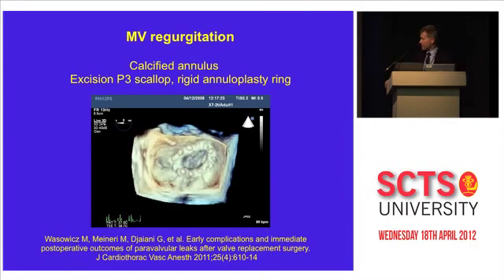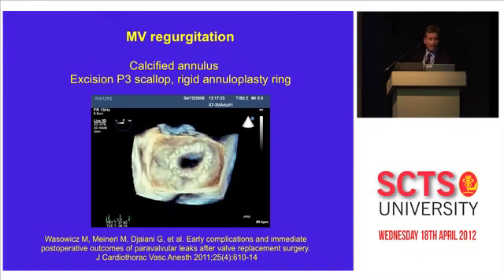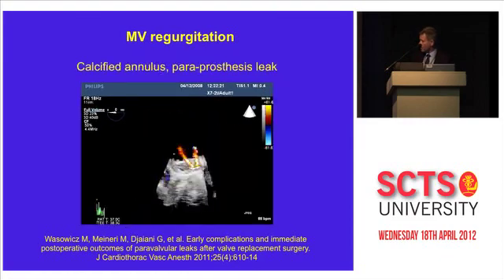And you can have sympathy. It may be very complicated to put a suture through there. They don't want to damage the circumflex coronary artery or the coronary sinus or whatever, and therefore the surgeon picked it like that. And then, lo and behold, a big paravalvular leak, or actually 2 jets going through.